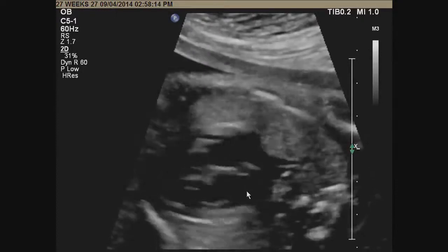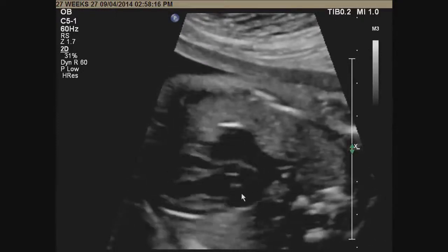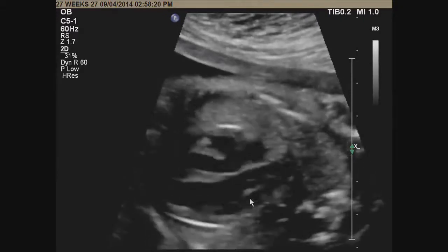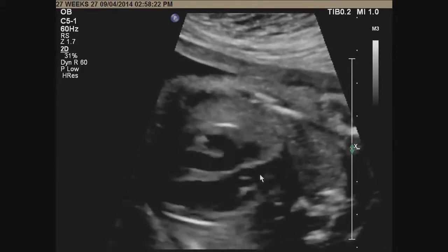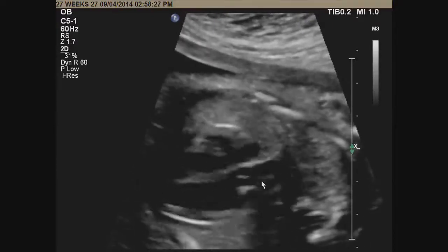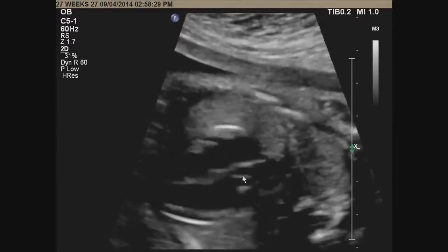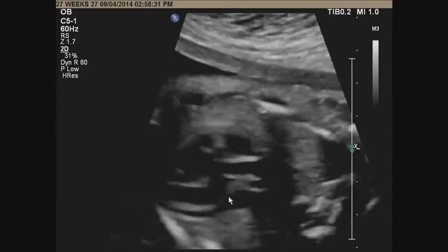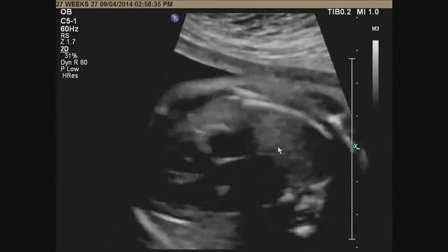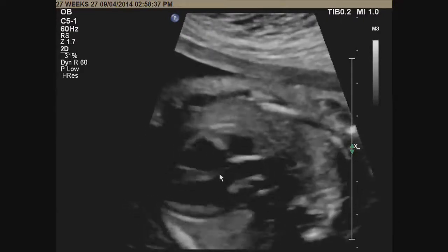The other important feature of this view is to look at the continuity between the mitral valve and the aortic valve. They are in the same plane, and this anatomic continuity is really what you look for when you're talking about double outlet right ventricle and so forth, where you lose this anatomic proximity and continuity between the two. So the mitral valve blood comes in and goes out through the aorta in the same anatomic plane.